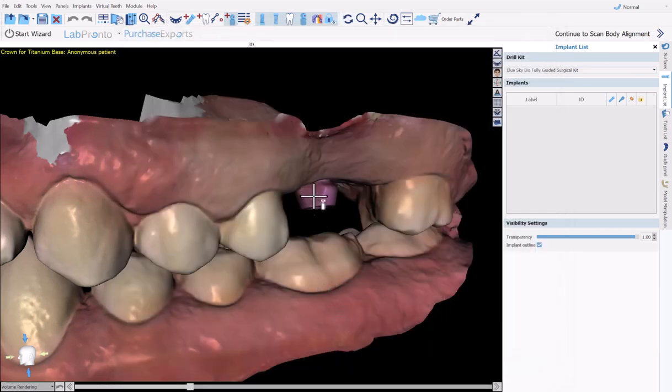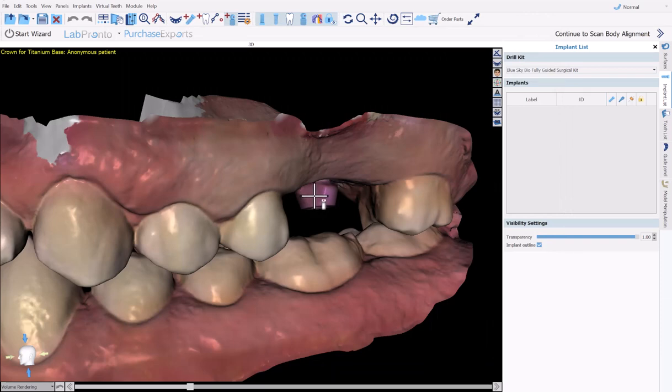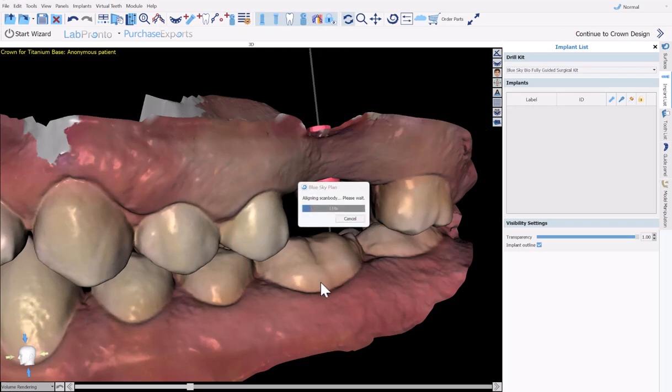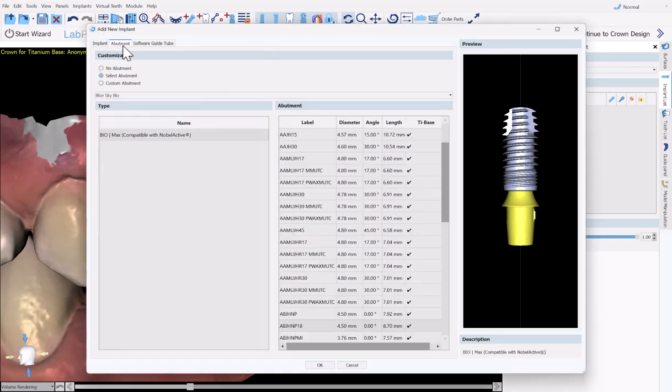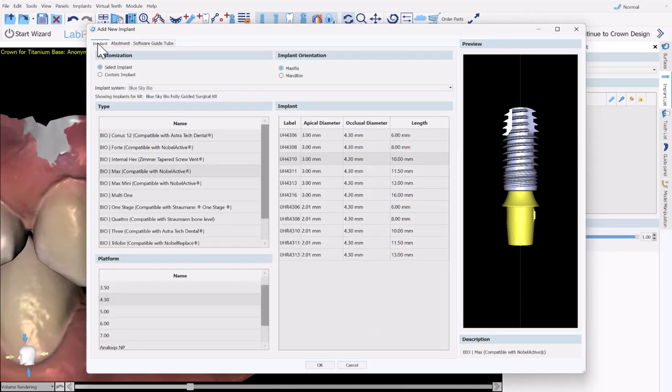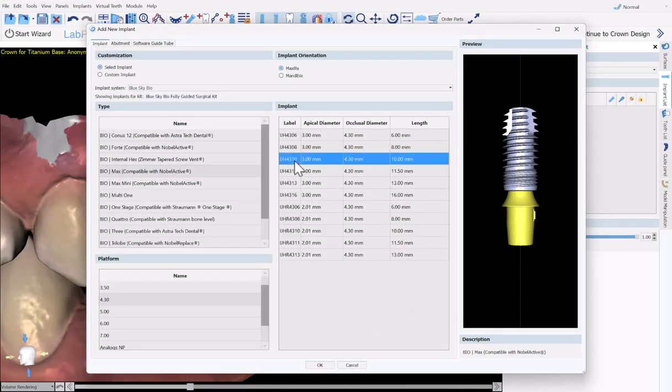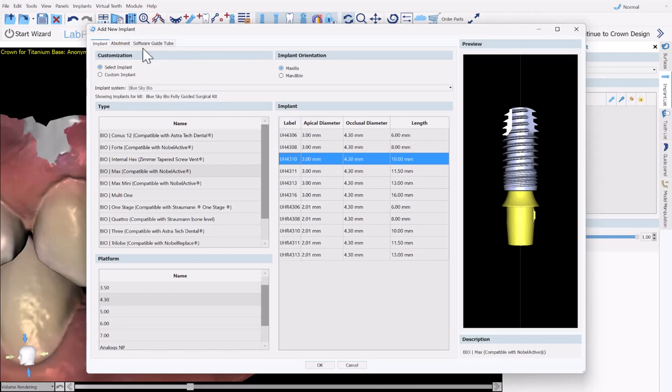Now we're going to left-click once in the center of the flat part of the scan body. We see that the scan body alignment is now running. And you are now prompted to select the relevant abutment and the relevant implant that was used in the case. Of course, you'll be able to switch the abutment if needed at a later point. Once you've selected the implant and abutment, click OK.